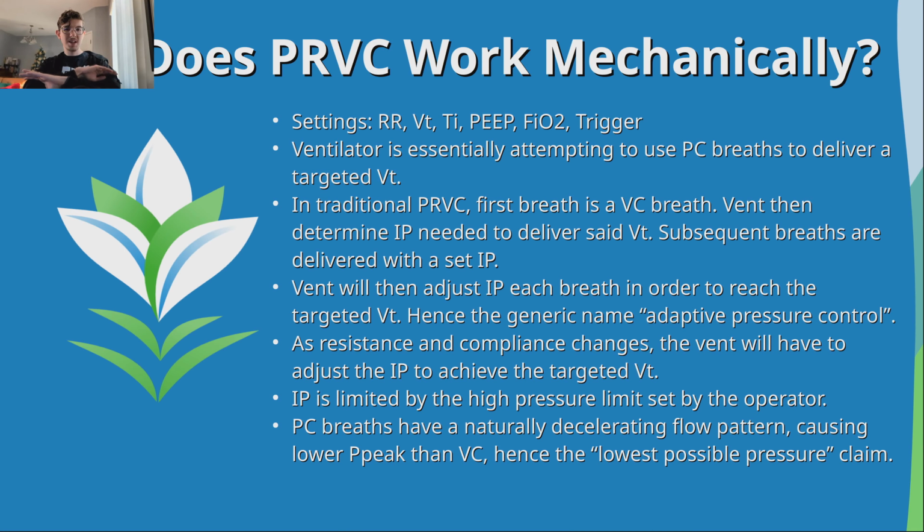Here's the easiest, most simple explanation of PRVC, okay? The ventilator is attempting to use pressure-controlled breaths to deliver a targeted tidal volume. It is attempting to do volume control using breaths with a set inspiratory pressure, okay? Let that sink in. Now, here's how it works.